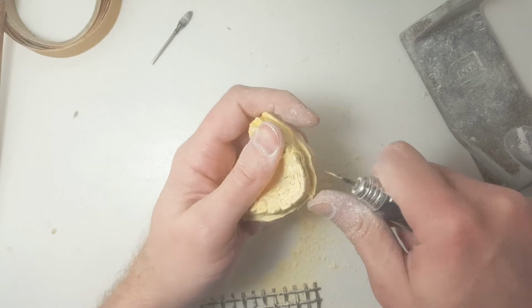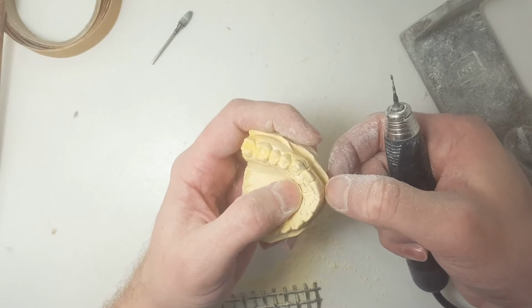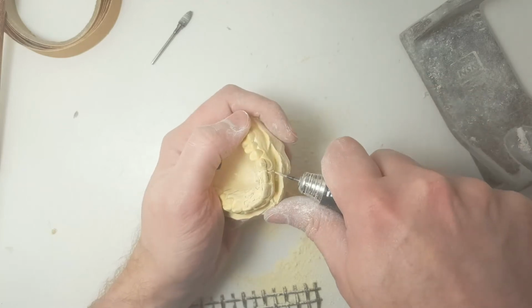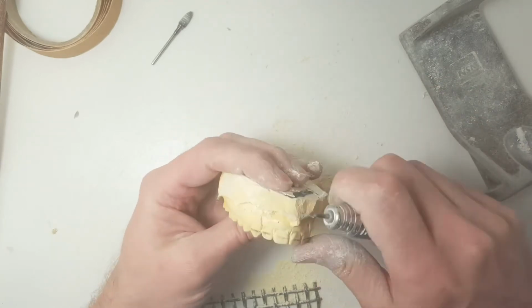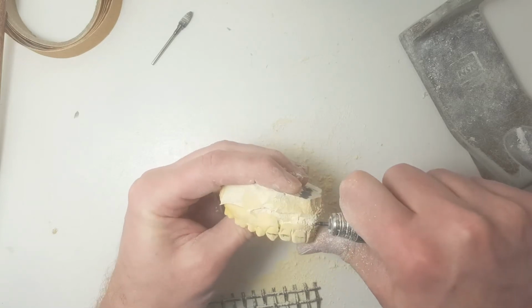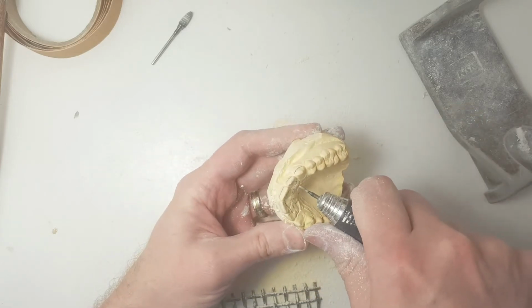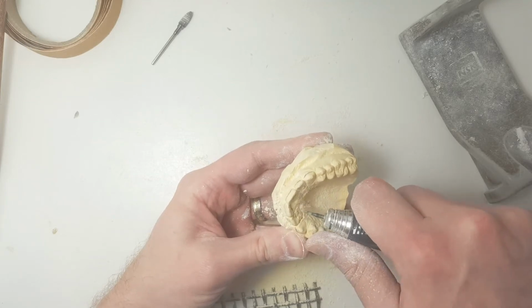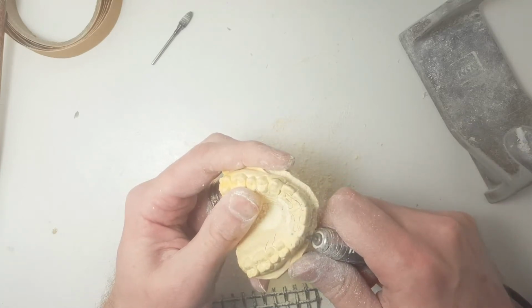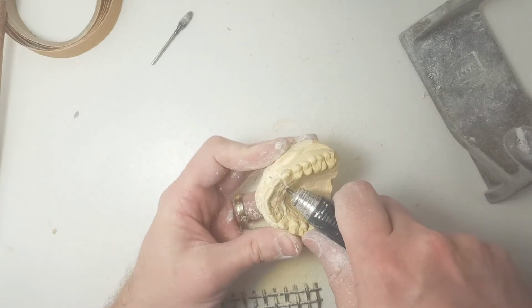Sometimes on these uppers, it's so thick facially, lingually, that you can kind of tell my burr is going to be a little short. So what I may do is just do the front. And I'll do the lingual. Okay, now let me see if I can connect those two. There we go.